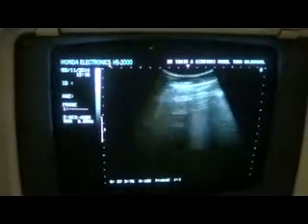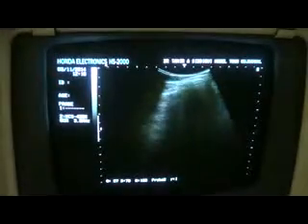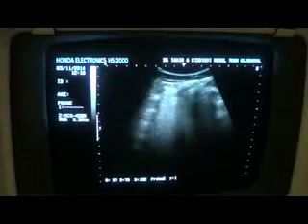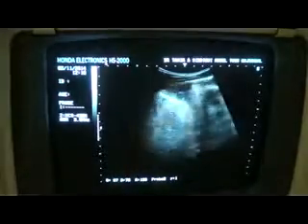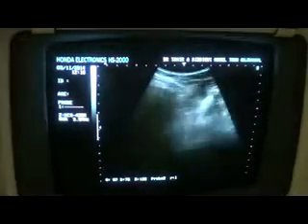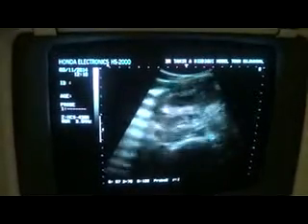Now from the epigastric region, I am moving the probe down up to the umbilicus, and nothing is seen except bowel gases. This pattern of bowel gases from the epigastrium to the umbilical region, and rather all of the upper abdomen, is consistent with developing peritonitis.